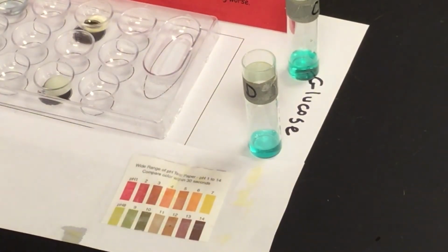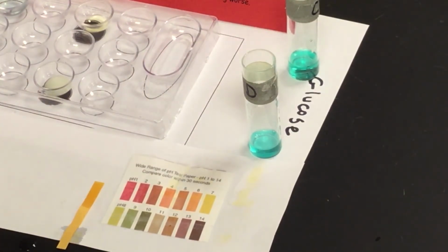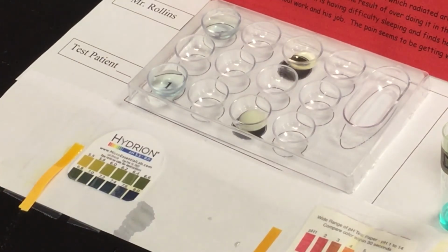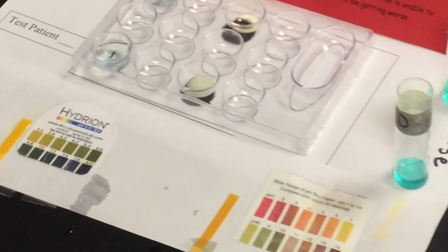I'm going to take a drop of patient number 16's urine and put it down so you can record the pH that you think it is. Try to match that color up with one of the colors on this wheel. Mark it down. It's not going to be very specific because they're whole numbers. My second type of pH paper, next to it, goes 5.5 to 8, so it's a little more exact. Do the same thing with that strip, matching it up with that color wheel. So give me those two pHs, best that you can.